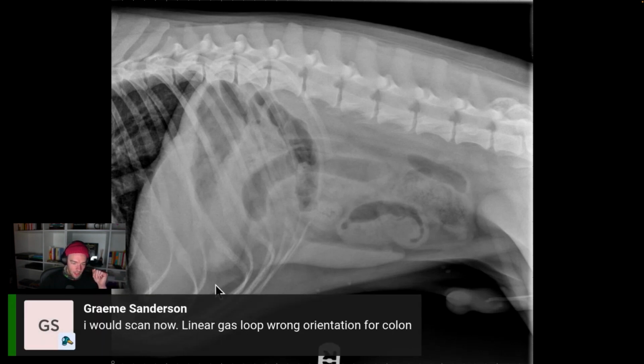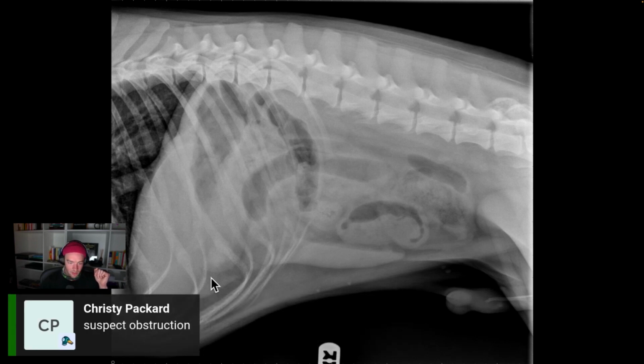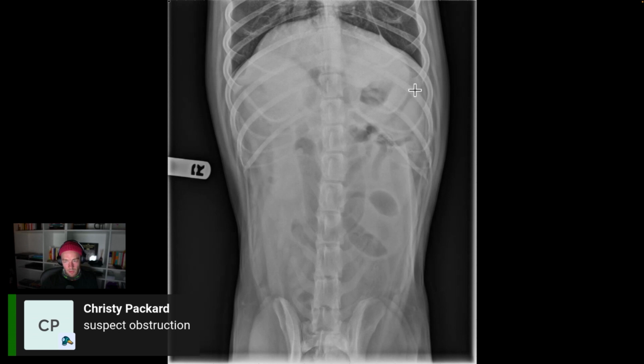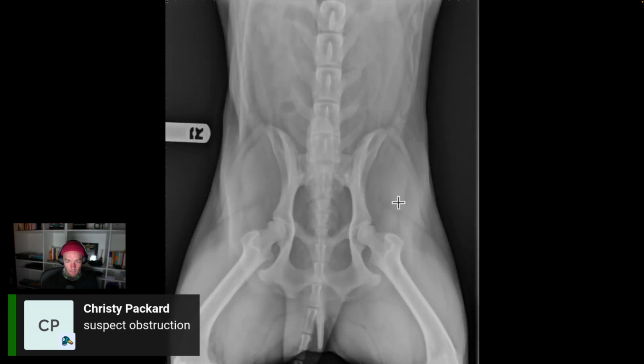Let's talk about the liver. Okay, gastric axis is tipped a little cranial. I don't know. Sometimes the left lateral view gives you a little bit more liver. Spleen here, kidney. There's the caudal pole of one kidney. Right kidney, I can't really see. The stomach, mildly distended, mostly with gas, but there's maybe something here. A little bit of an opacity here. Okay, urinary bladder fluid opaque, small, mineral opaque calculi, no. VD view. There's the splenic head, little triangle of love. Here's the stomach right here. Okay. Hip joints. Very nice.